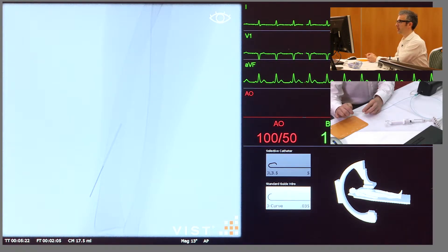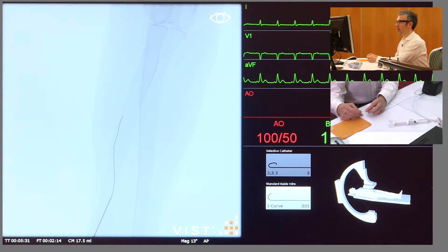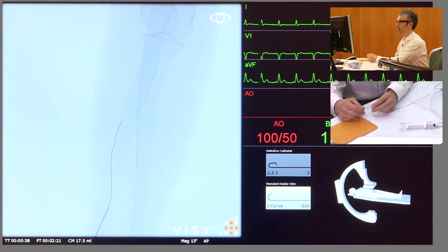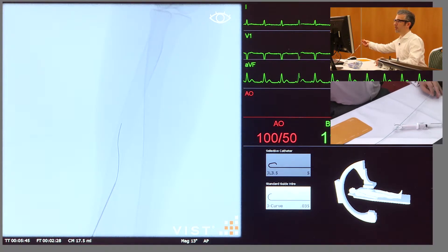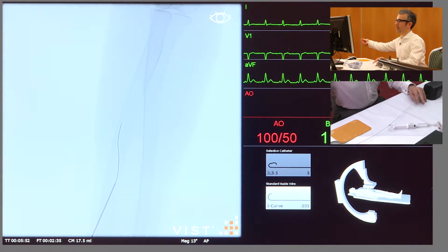We're going to be slowly advancing the guide wire, which you will see assume its J-tip shape as it emerges from the sheath. I have a mental roadmap in my mind of where this wire should be heading, and I'm looking to see whether I get any resistance as I advance the wire, to warn me that I'm in any small branches. You can see I'm getting a little bit of resistance there, so what I'm going to do is just bring in the guide catheter — but not take the catheter past the tip of the wire — and we'll take a small angiogram and see exactly what's going on and draw ourselves a roadmap.